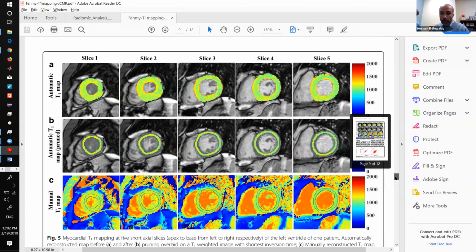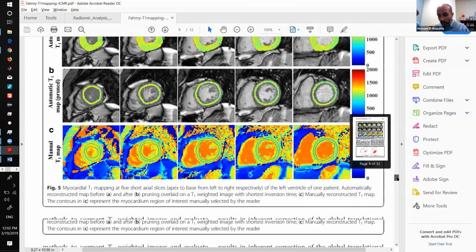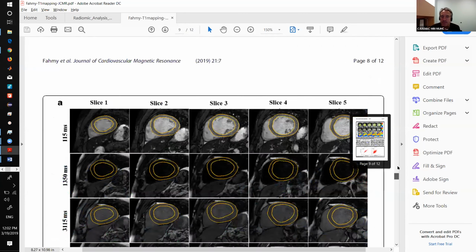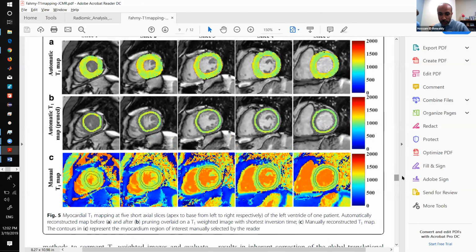You're talking about the network, the training of the network, right? Yeah. So actually, this is a good question. We have this 210 patients for the training and testing, but we use only 63 cases for training, which is 30% of that set, which is smaller relative to what's usually done in this field.